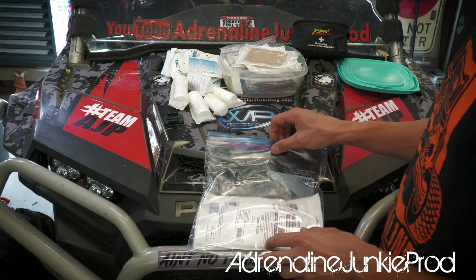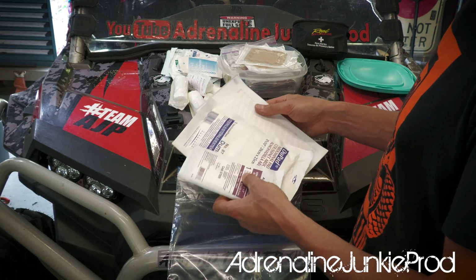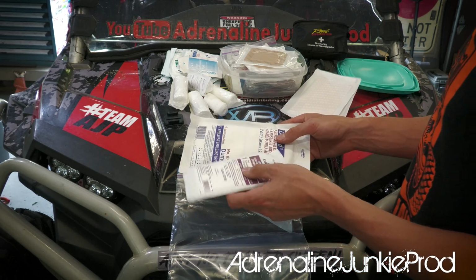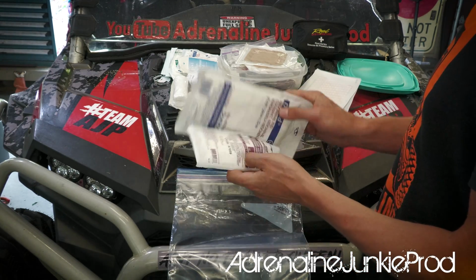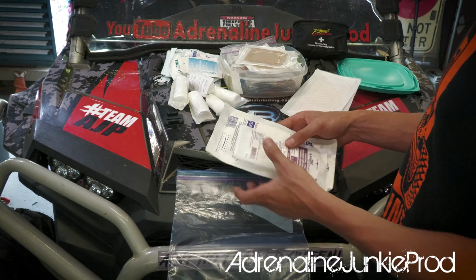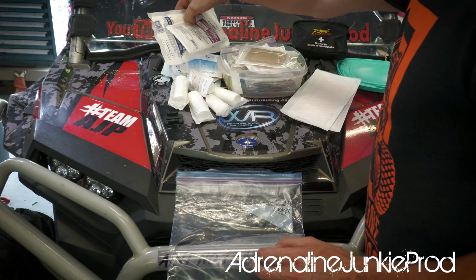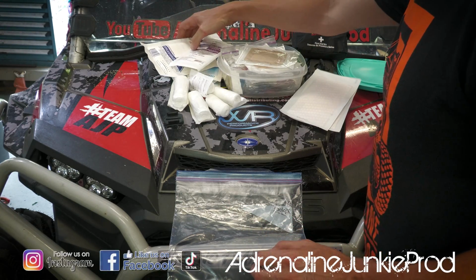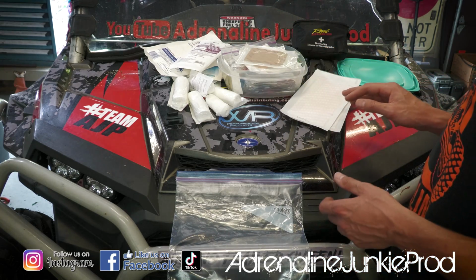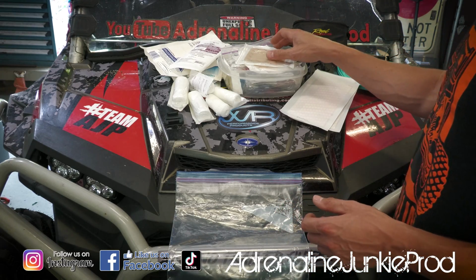Something really important to have is some abdominal pads. These are super absorbent and super big. They're great for like a big cut on a leg or something that's seeping a lot. You can wrap them up with this cling. These are good to have. These things, although they look big, you can squish them down. You can put them in a Ziploc bag, and they don't weigh anything at all pretty much. But you need that stuff to help clean the wound and keep it covered up after you dress it. And that's what you'll be dressing it with.